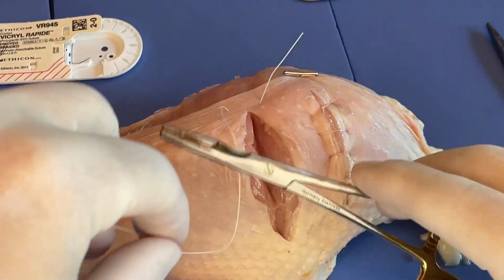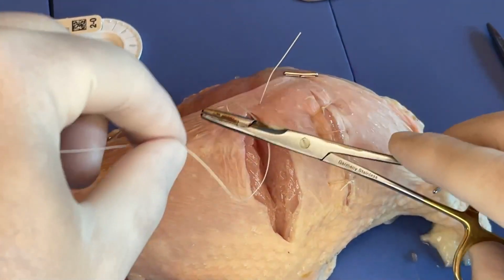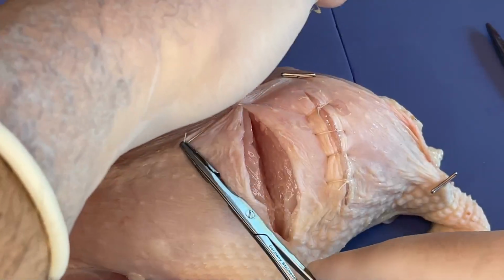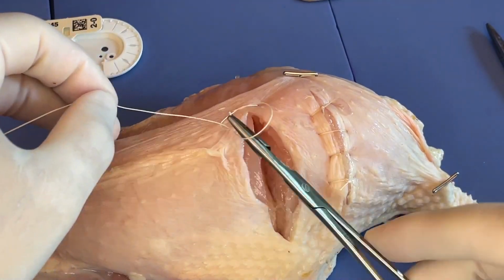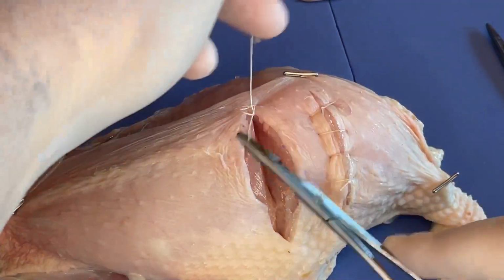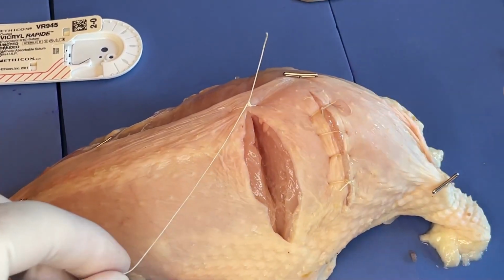So let's talk about instrument tie real quick. It's the same thing, it's just getting a loop of tissue and then pulling a free end through it. So wrap your loop around the tip of the needle driver and pull through, wrap the loop around and pull through, wrap, and through. So 4 throws there for Vicryl.